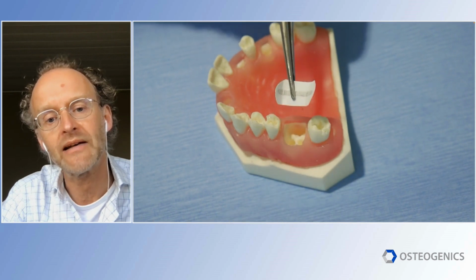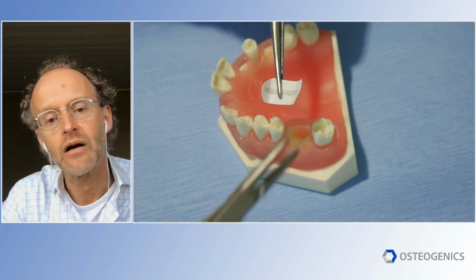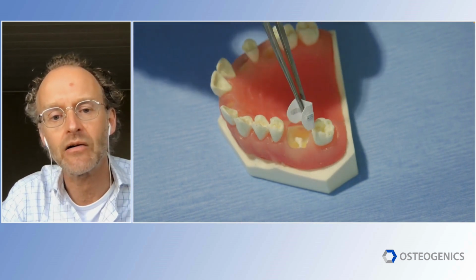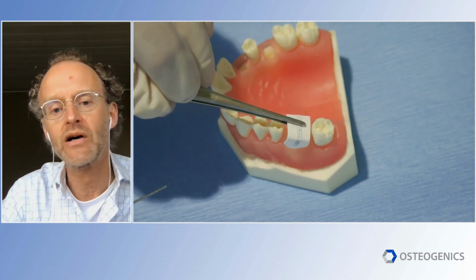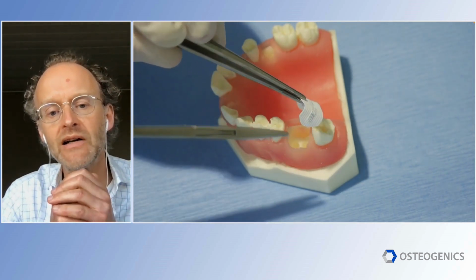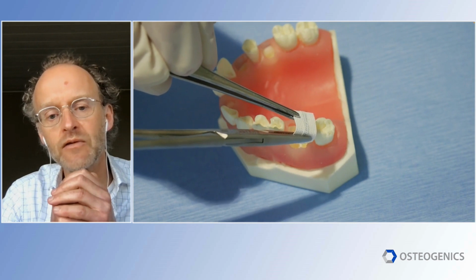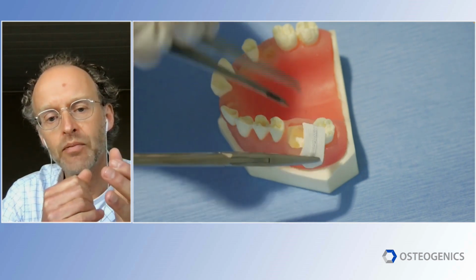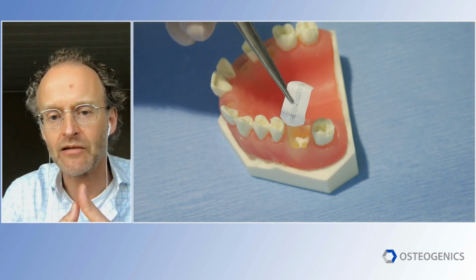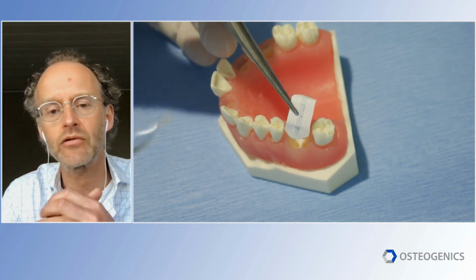And then we're going to bend it with a surgical tweezer. And make sure that you really bend it in a 90 degrees angle. So you really, what I call a kind of square U-form shape, to have a really stable scaffold. If you're done with this, you bend it open a little bit, so you will be able to place one side of the membrane and later on the bone graft.